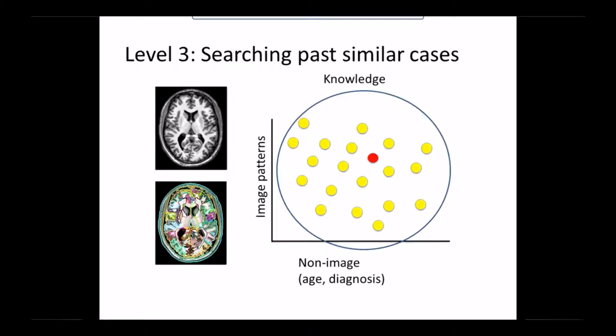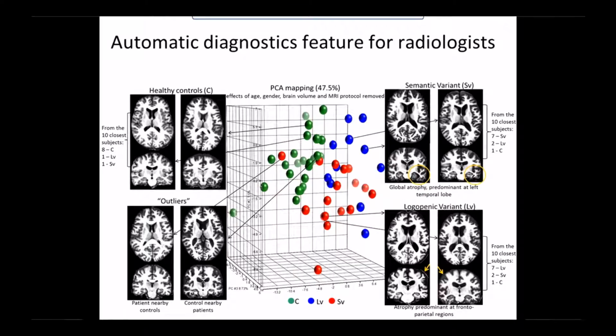They can take the image on the left, structurize it, and then go into the database of logged patients and say, independent of the clinical record, I know this is a 44-year-old woman, and I know she's had temperature 3 times in the last 2 weeks. I'd like to know what other cases in the training database that's been looked at are similar, because I'd like to see what previous data is saying from other doctors on the floor.